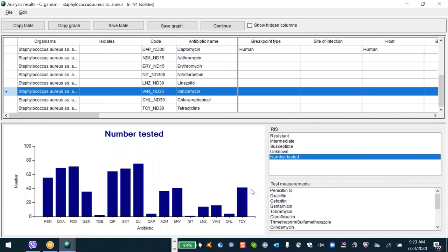What I know is every time there is a shortage of antibiotics, they use what is available in the lab. And it's nice to know what the reason is, because the reason you just said does not introduce a bias. They wanted to test it, but they couldn't. So the data are not 100% complete, but they are representative. If the reason we only have gentamicin half the time is because they ran out of discs, then the percent resistance is still reliable because there's no bias because of missing discs. On the other hand, if they only test gentamicin on multi-resistant ICU patients, then we have a bias. So the reason is valuable with regard to understanding. Does that make sense? If you ran out of discs, there's not a bias there, it's just randomly distributed. But if the reason you tested it was because it was an ICU patient or a resistant isolate from the first line testing, that introduces a bias.